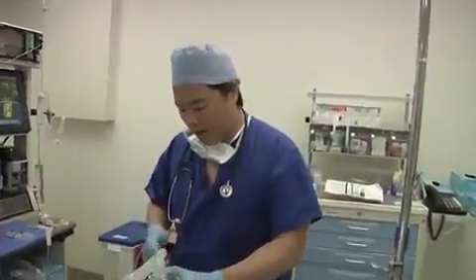real time the effect of the induction agent on the patient. And once I see those eyelids starting to close, and then when they're completely closed, I'll have an idea that the patient has been successfully induced for anesthesia. And I do see that.